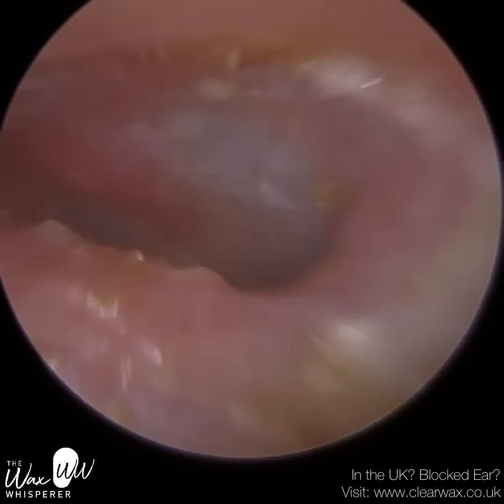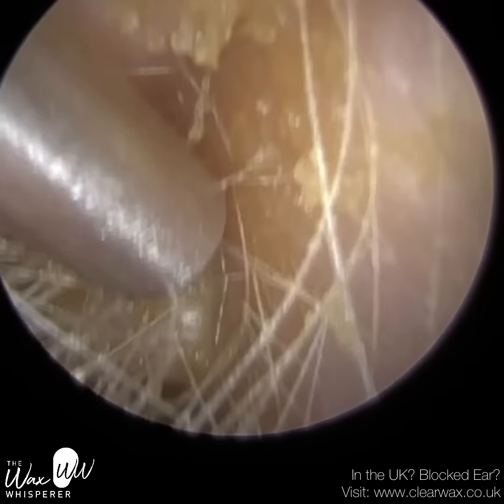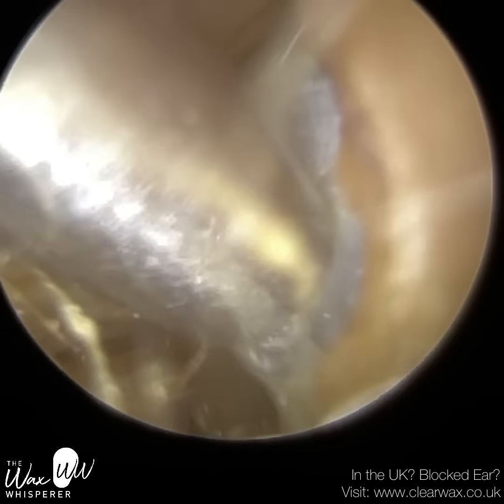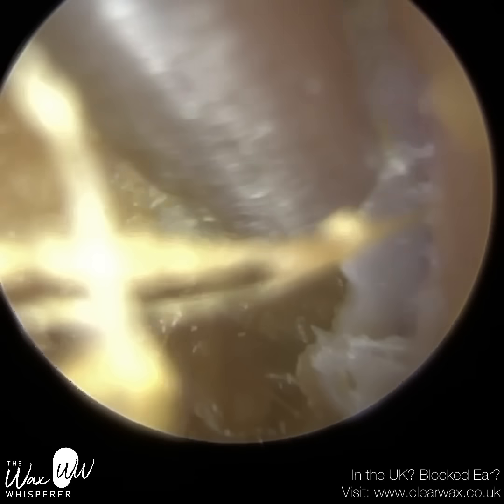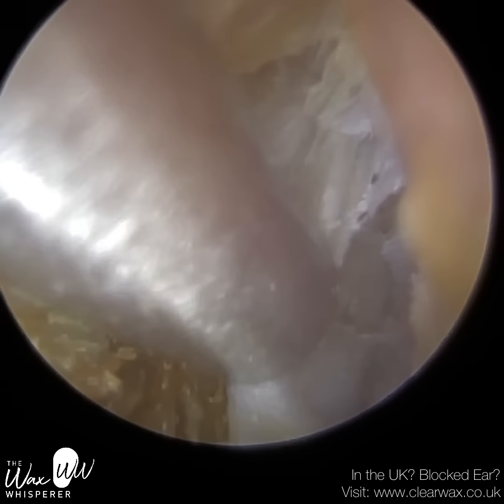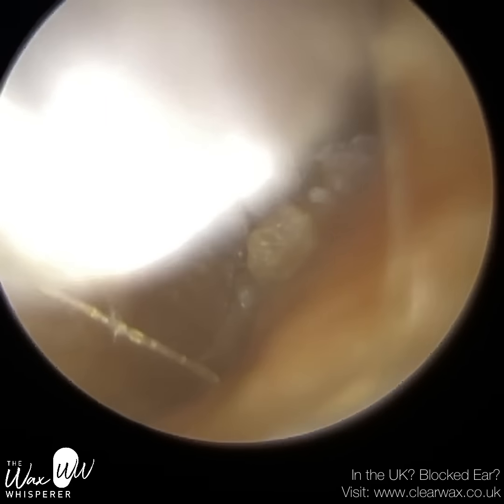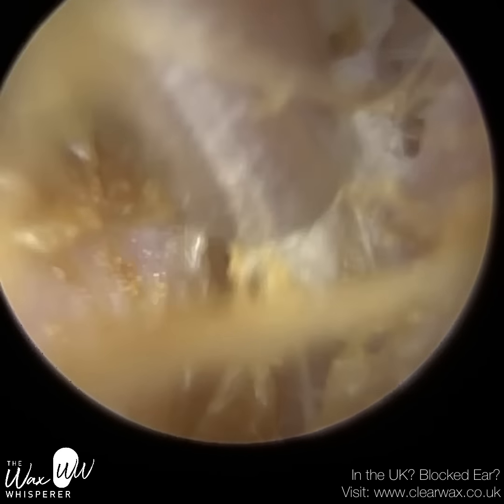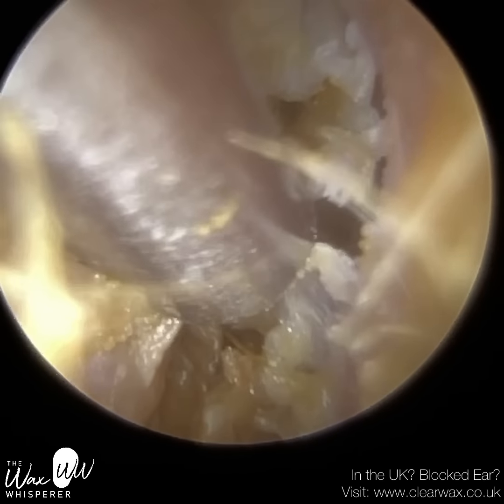So a final look at the eardrum, which we couldn't see before. This is the patient's right ear. Once more, they've got otitis externa, a lot of dead skin. You can see this layer of skin here on the right hand side of the ear canal, the anterior canal wall. This is a fresher layer of skin that's died and shed, but it's failed to migrate out of the ear. Eventually this layer will get compressed deeper and deeper into the core of the plug as you have more and more skin dying and shedding on the canal wall.